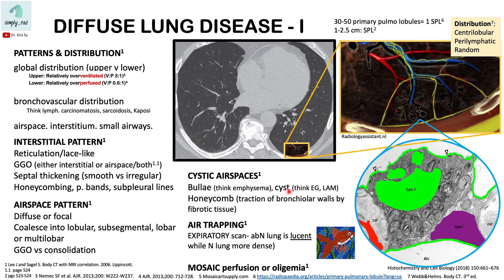A thin-walled cyst should make you think about eosinophilic granuloma or histiocytosis X in a 30-year-old smoker, or lymphangioleiomyomatosis (LAM).